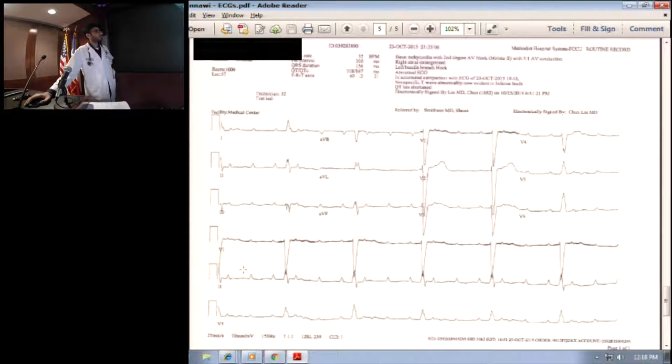So just remember, not all paroxysmal AV blocks are the same. You can have tachycardia-dependent paroxysmal AV blocks, and this seems to be the case. Moises, you're going to be much better than myself, but let's see if it's pause-dependent or tachycardia-dependent AV block. The mechanism is basically that you have a sick heart, because a patient with cardiomyopathy, by pulling the catheter, and this has also been reported, you can trigger atrial arrhythmias, and the fast atrial arrhythmia is not given time for the myocardium to recover and the His bundle to recover and conduct.